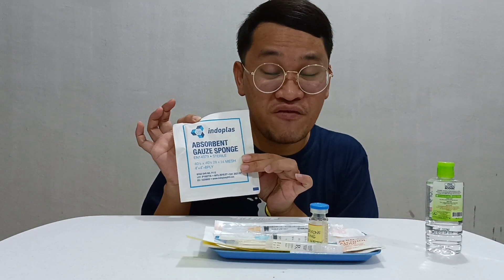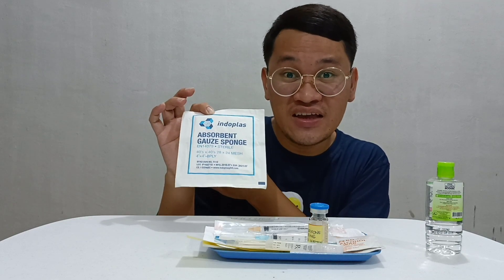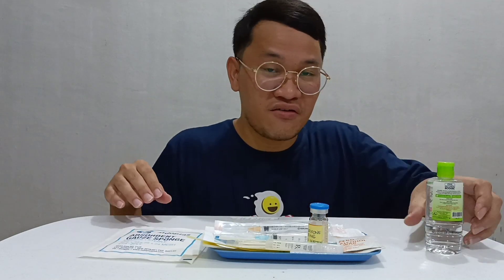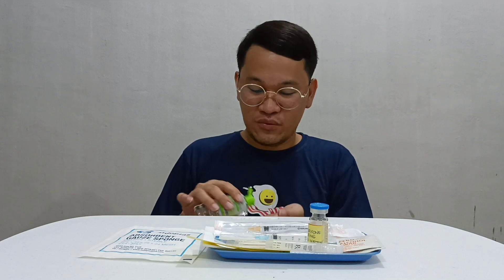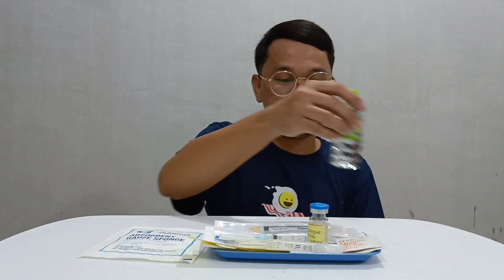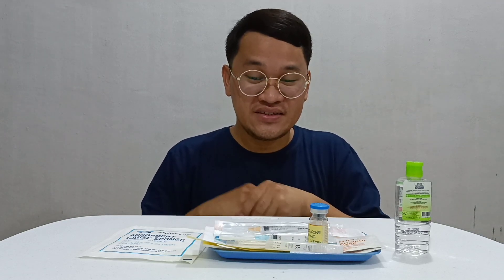I also have here the gauze — this is 4x4 — in case the patient has a bleeding tendency after the intramuscular injection. And right here I have my antiseptic solution for hand hygiene. I will now do the hand hygiene and proceed to the preparation of the medicine.